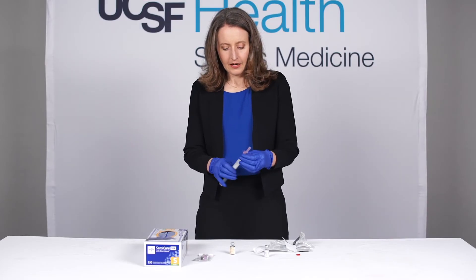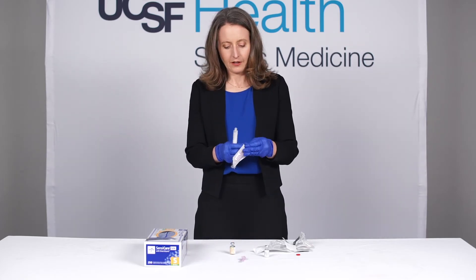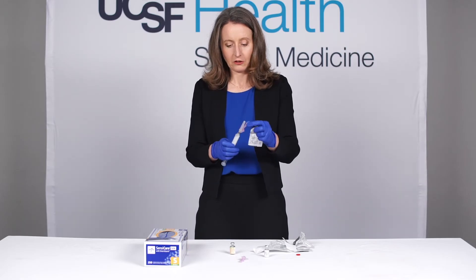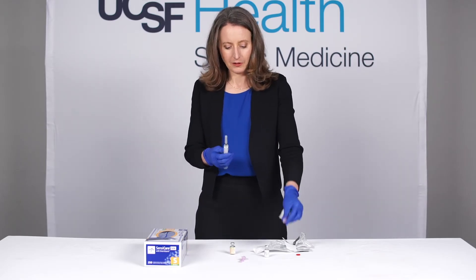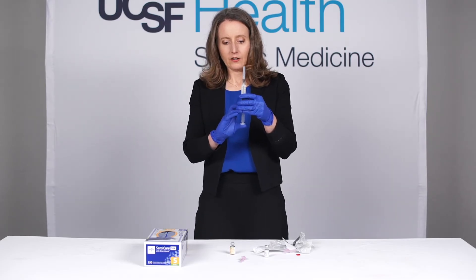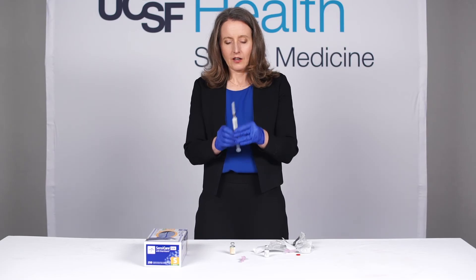You can cap the safety and then take off the needle that you drew up with and put a fresh needle on the end of the syringe, because this is what you're going to use to inject the patient. I like to take the safety off because it sort of gets in the way. Lastly, just remove any air from the mixture in the syringe and you're ready to go.